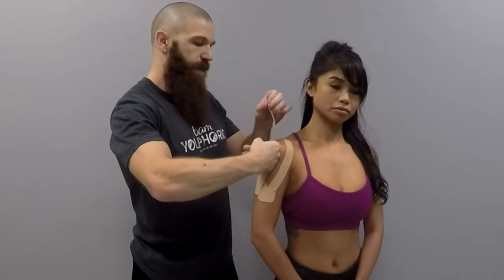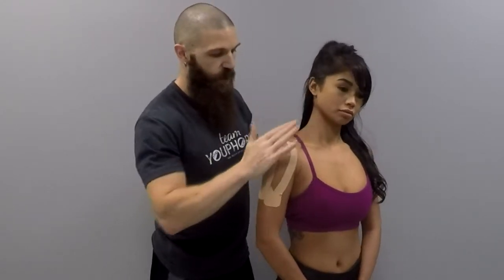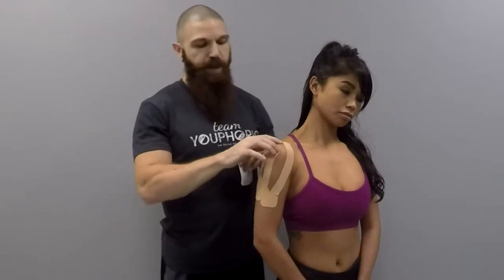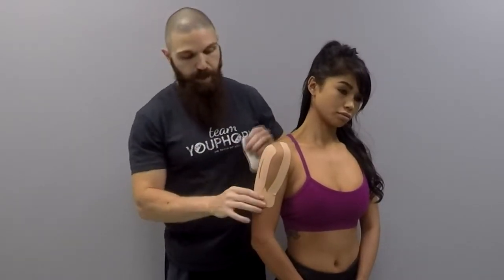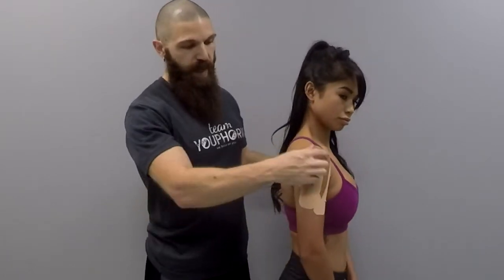You want the I-strip to end at the coracoid process. This one I cut a little bit short — you want it to end a little bit higher. Basically, I-strip with a slit down the middle, all the way to the coracoid process.